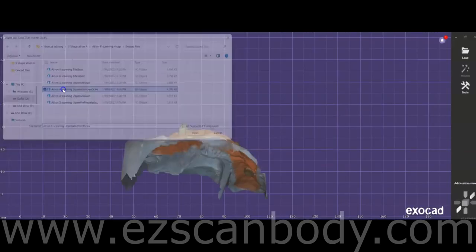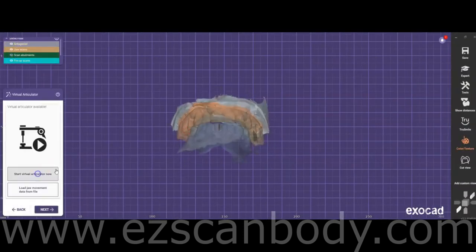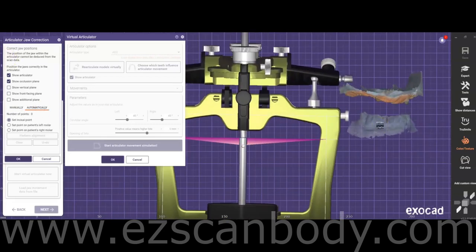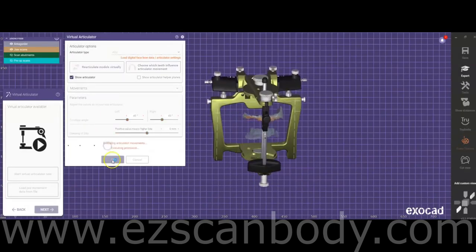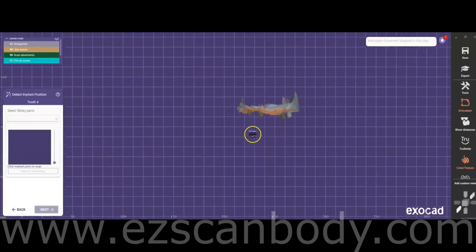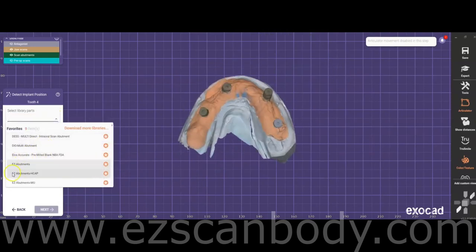Import the files and carefully check them to ensure everything is properly aligned and accurate before proceeding. In the articulator, position the models and align them with the horizontal plane. If requested by the doctor, you can adjust the bite by opening or closing it at this step. At the Detect Implant Position stage, select the library option EZed Abutment H-Cap — this corresponds to the scan body used to scan the multi-unit abutments in the patient's mouth.